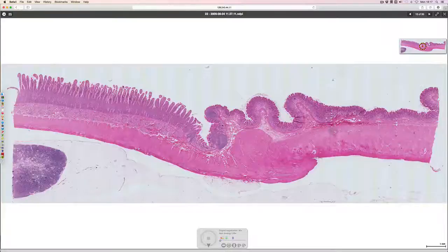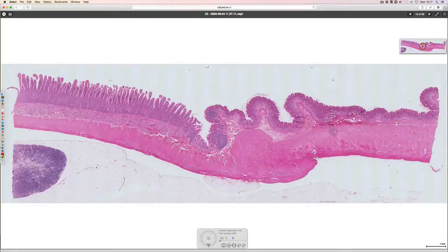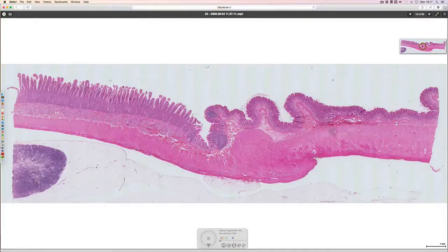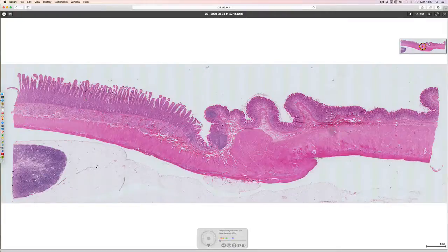That was the stomach epithelium. Following it along until we reach the junction, there is a change in epithelium at this point and we get a different sort of mucosal structure, where we can see long finger-like projections poking into the lumen. These are the villi of the small intestine — folds of mucosa.